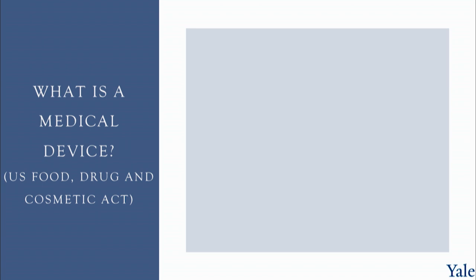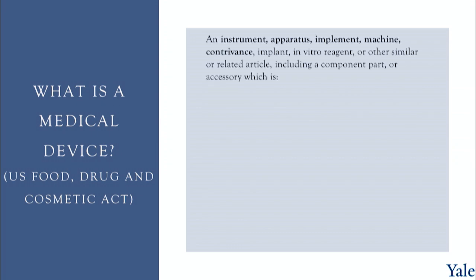Now, what is a medical device? If our software falls under the purview of the FDA, it's a medical device. It will be classified as a medical device. So let's see what the rules of what medical devices are. And then in the next slide, we'll talk about what is not a medical device as a point of comparison. I apologize for the details. It's sometimes worth seeing some of this language just so you understand what these documents look like. So we'll go through this definition slowly.